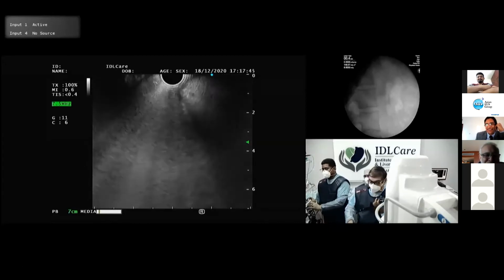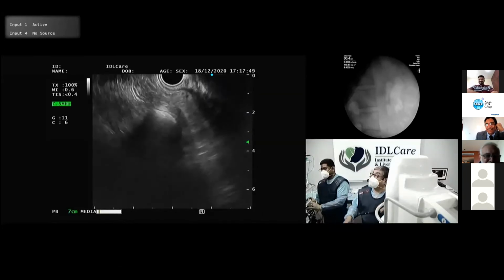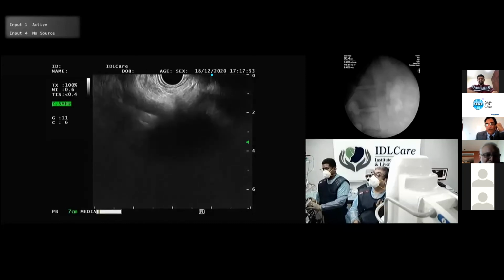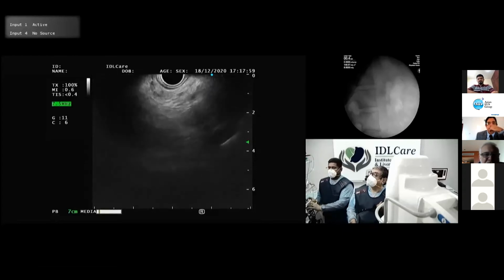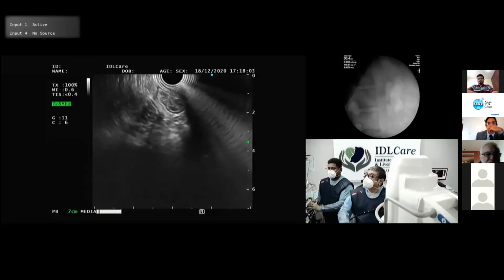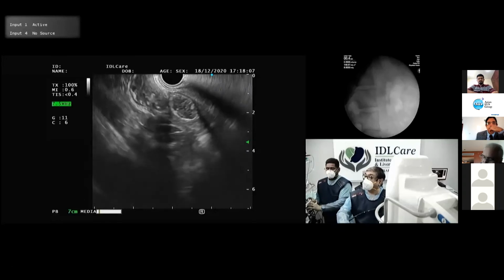Let me see. What I will do is, I will not try very hard. I will make 1 or 2 punctures. If I don't get the duct, we will come out. Is that okay? Yes, perfect. Via media, we will not try very hard. So let's go back. Now that we have changed the position, I have to go back again. Endoscope, please.